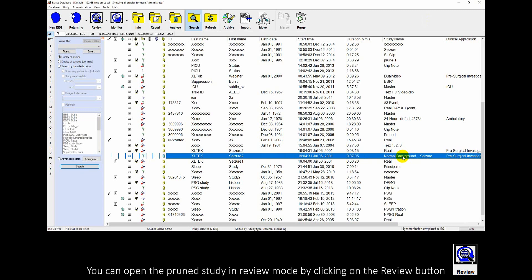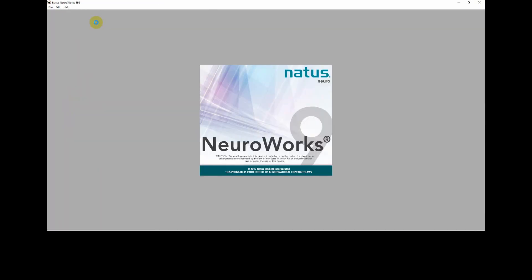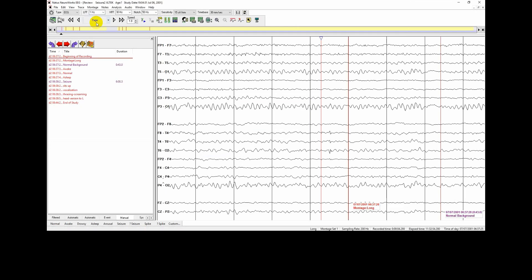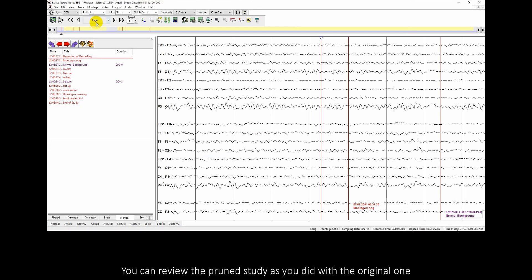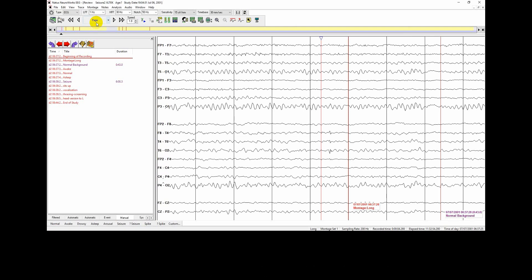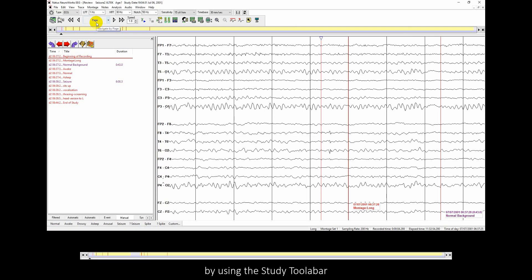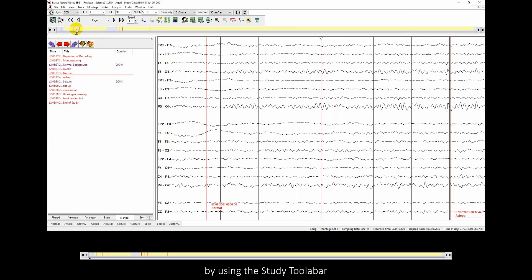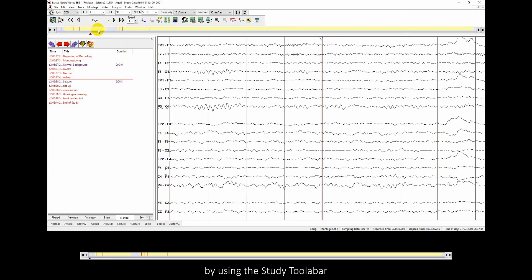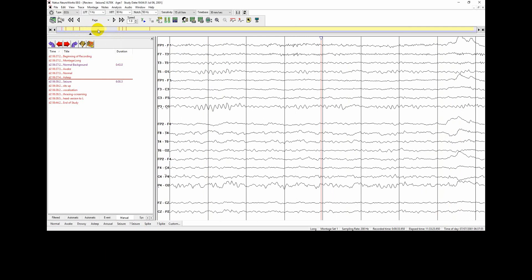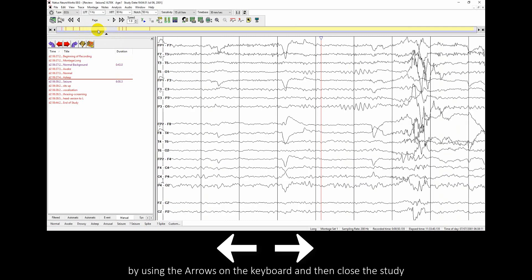You can open the prune study in review mode by clicking on the review button. You can review the prune study as you did with the original one, by using the study toolbar, by using the arrows on the keyboard, and then close the study.